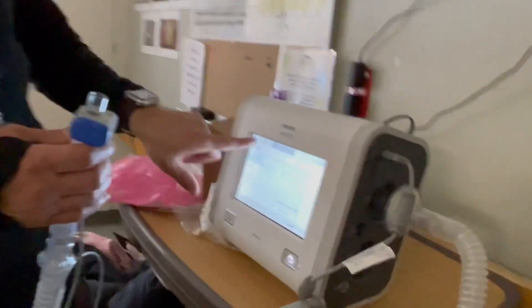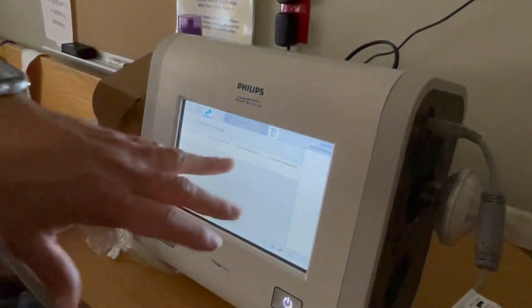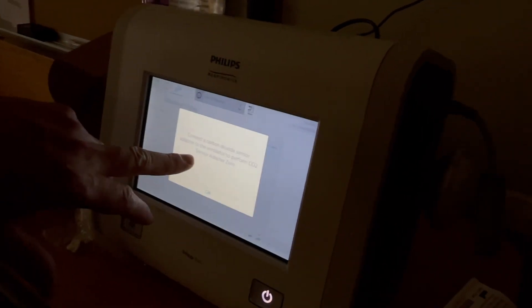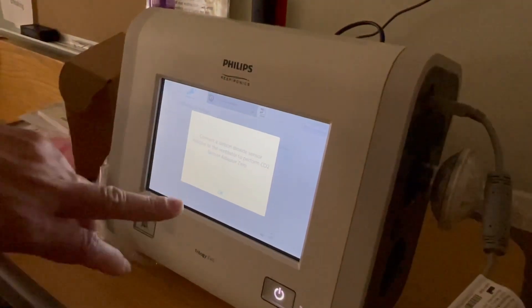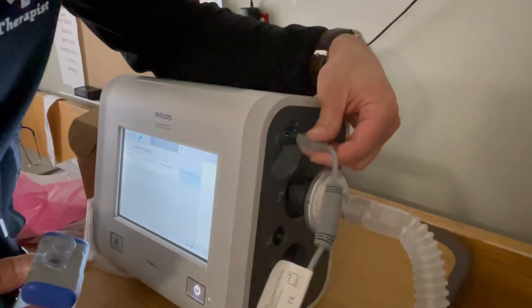When I go in here — again, this is something you really don't need to do — I'm going to go to CO2 sensor connected, carbon dioxide sensor adapted to the ventilator. It didn't notice that I plugged it in because I plugged it in before I turned it on.